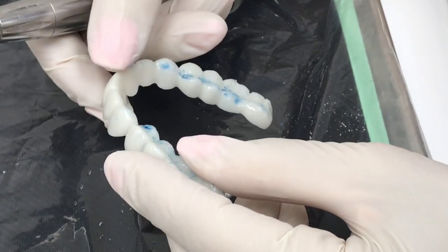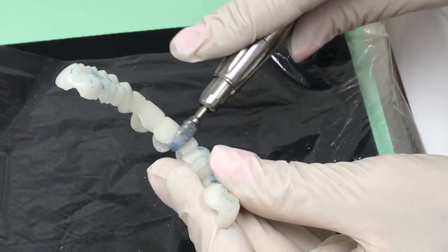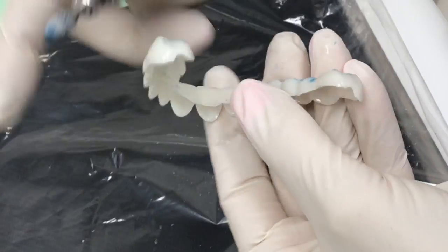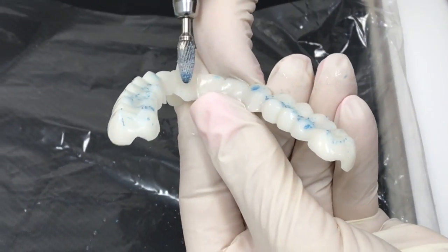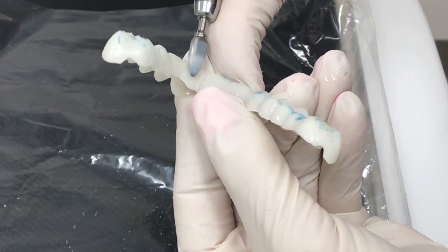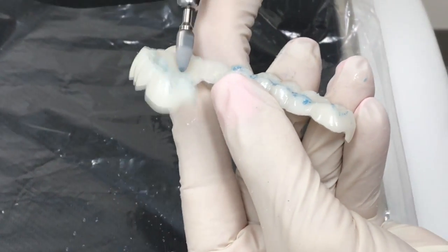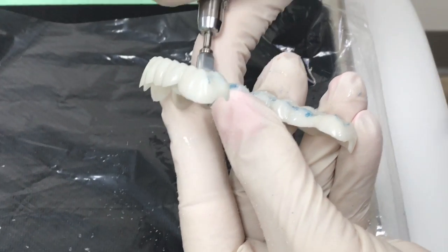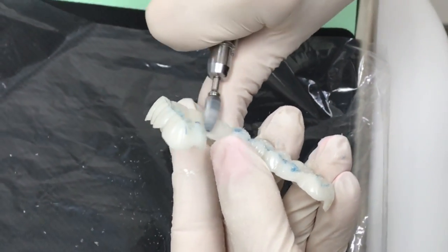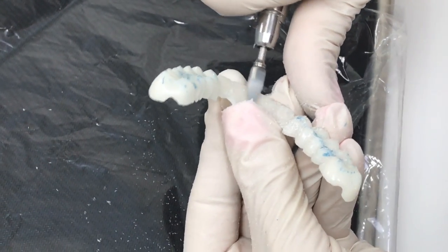Okay, so he had a lisp. When he said 66, I heard a lisp. So how you adjust a lisp is you adjust the inside of the upper appliance. So we're going to go ahead and adjust the inside. And we don't take off too much. So again, we have our snap-on small burrs, and we're going to thin this out just a little bit so we don't have that lisping sound. Very easy to do. Of course, you can't do this at home. You have to see a dentist to have this done. All right, we're going to try it in again. Okay, say 66. 66. Sounds good, right? Yeah. So that's how you get rid of the lisp.